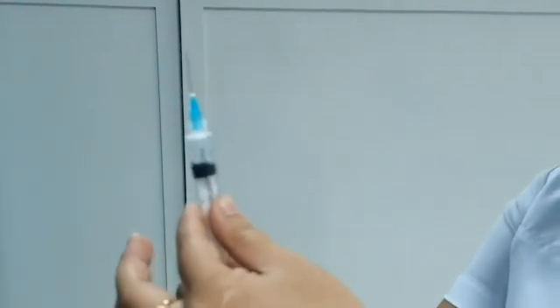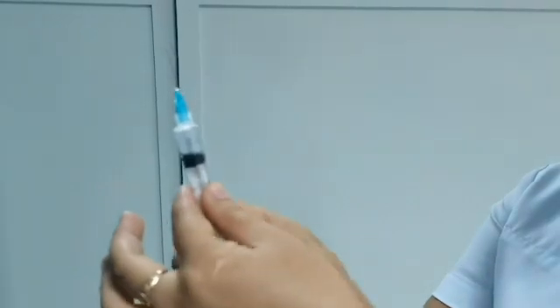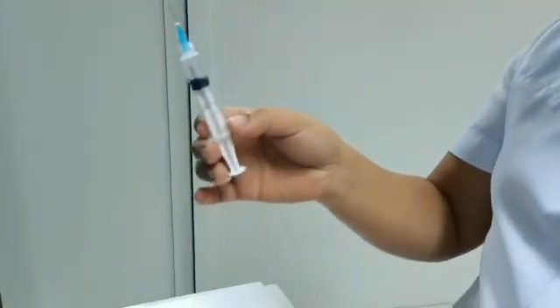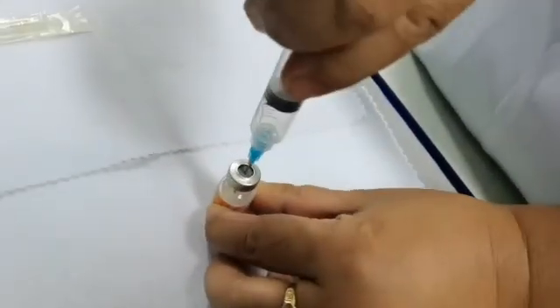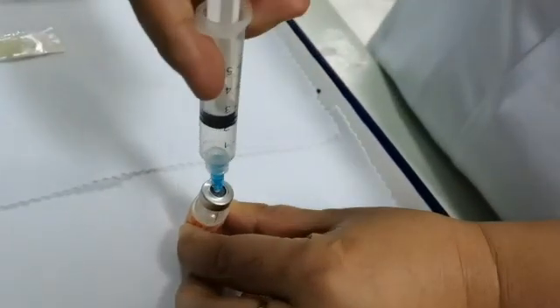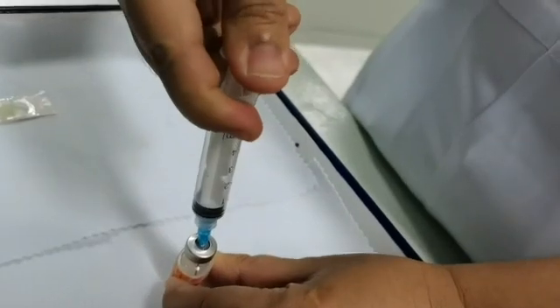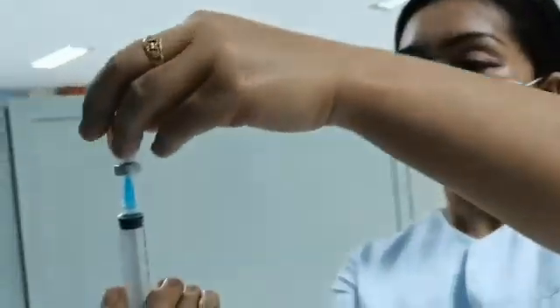So if it is 2, you measure 2 ml. Then you inject between the rubber, then move the plunger down to instill the air, then invert like this.